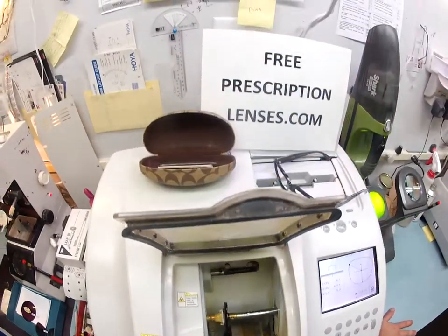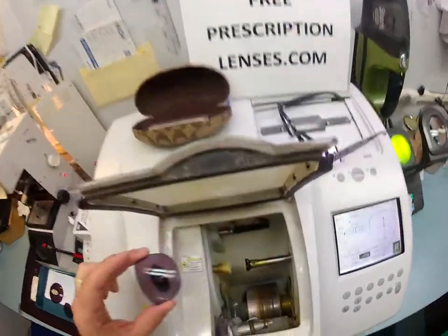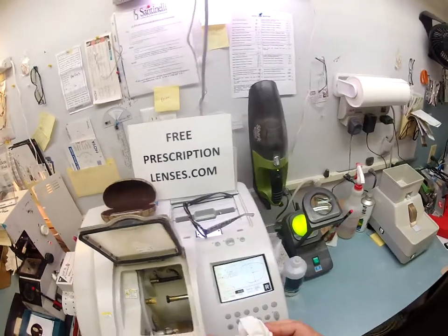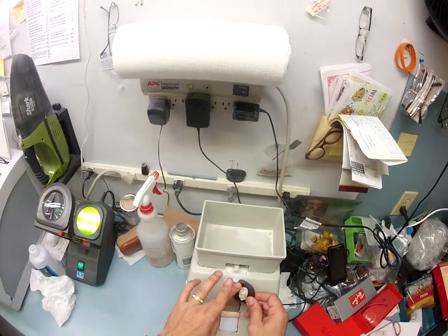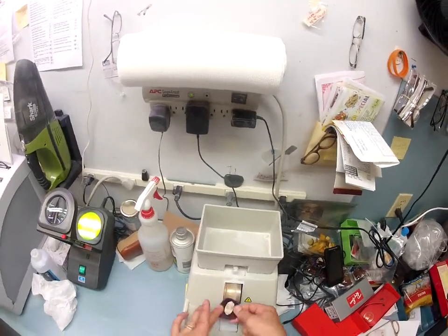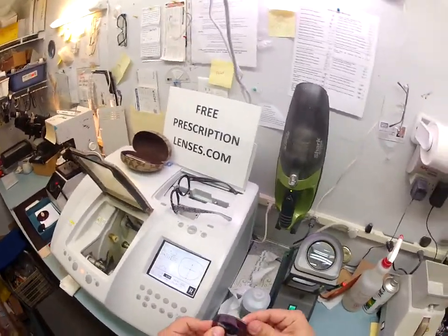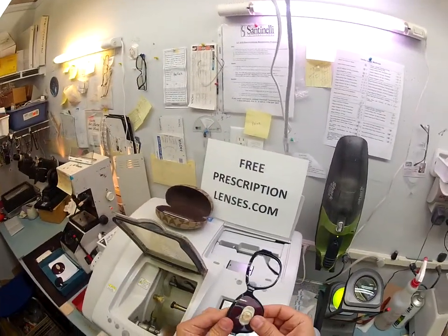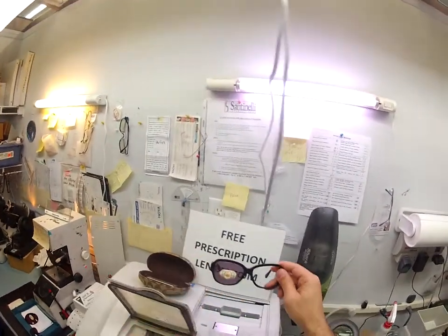Okay, so now we're done. I'm going to take your lens out of the chuck. Thank you, Chuck. Excuse me, Charles. I don't know you well enough to call you Chuck. I'm going to dry off your lens so it's not slippery, and you still have a little bit of rough edges going around, so I'm going to use my handstone, which is completely flat, and I'm going to put a safety bevel onto your lens. I'm going to clean everything up all the way around. Now it's much smoother at the edges, and I just want to see if it fits. So I'm going to tuck it in at the outside corner, and then using my thumbs press down at the centers, and it snaps in perfectly.